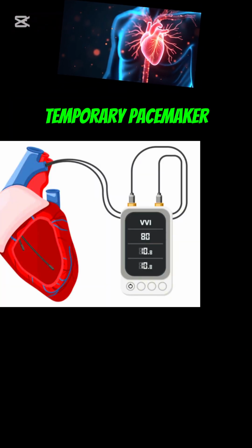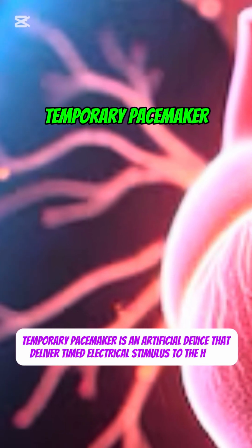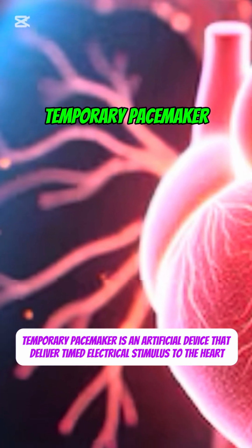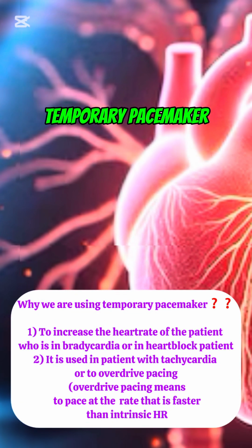Hello guys, in this video I'll be talking about the temporary pacemaker. A temporary pacemaker is an artificial device that delivers timed electrical stimulus to the heart. Why are we using a temporary pacemaker?